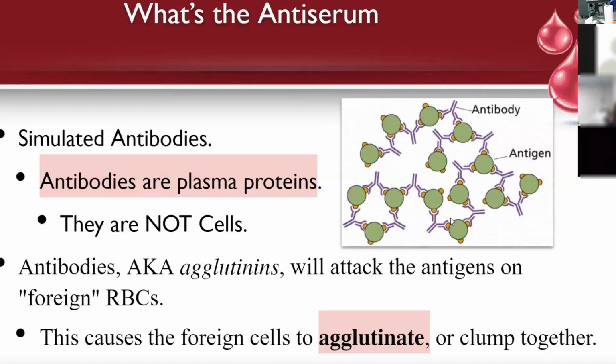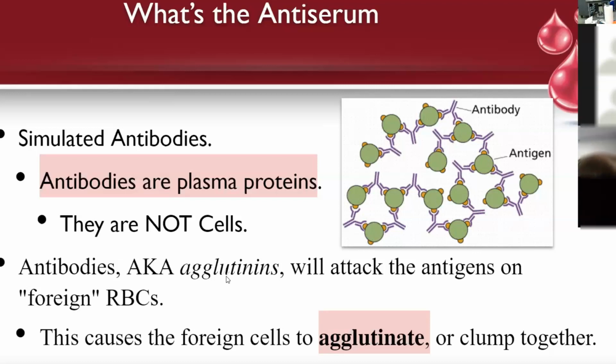And so really these chemical tests are just creating a precipitate by reacting 2 chemicals together. But that's what your body does. The antibody would react with the antigen and then causes it to be heavy because now it's a big clump and it falls out of solution. So it would precipitate. Okay? So we're going to use antibodies to try to find these antigens.